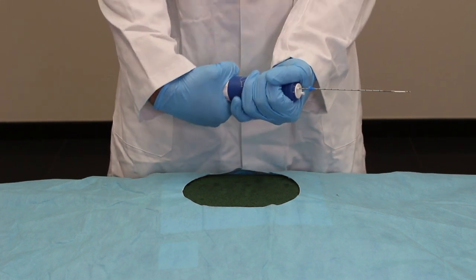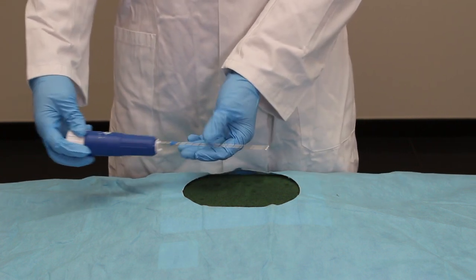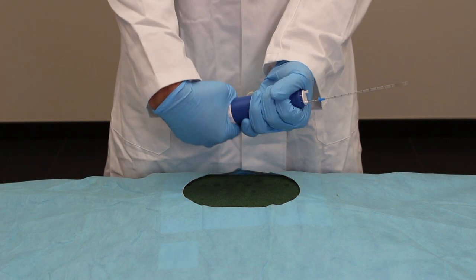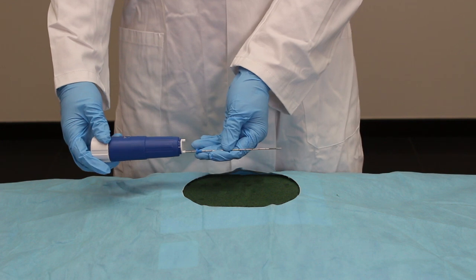One half turn will withdraw the cannula and lock it into place. An additional one half turn will withdraw the stylet and lock it into place. The instrument is ready to fire.